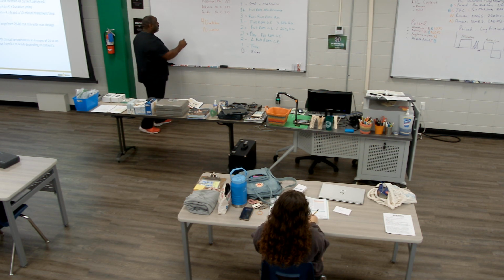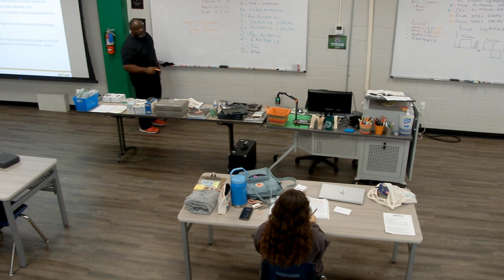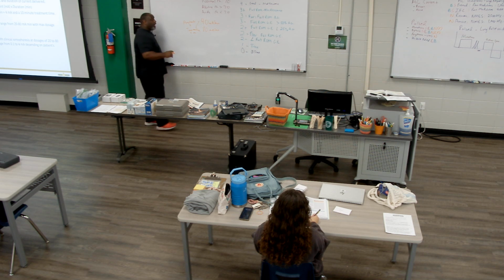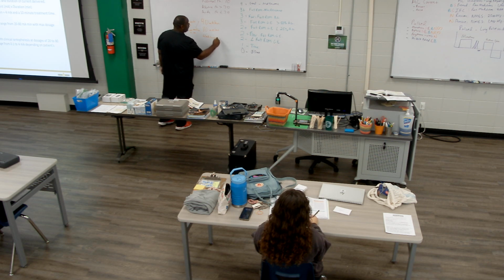It's a combination of time times amplitude: amplitude times the time the machine is on. So for a 40 milliamp minute dose, I would use 4 milliamps of current times 10 minutes.